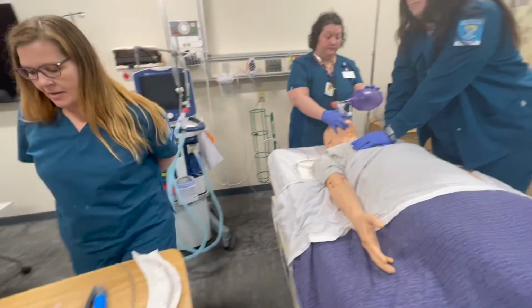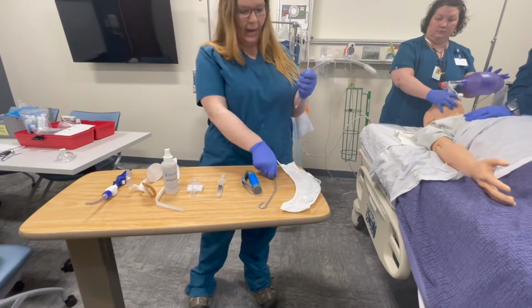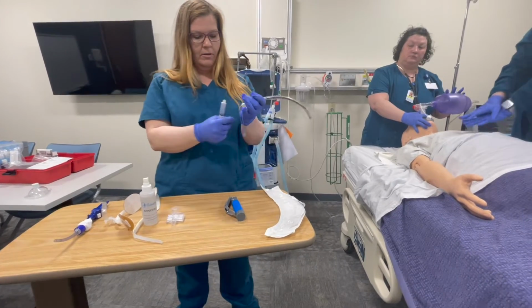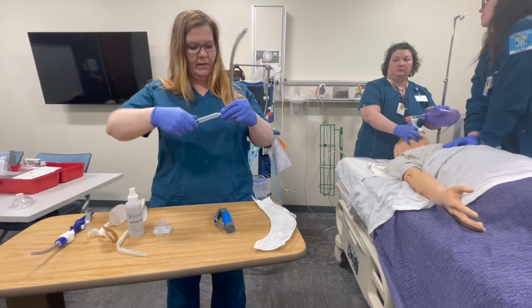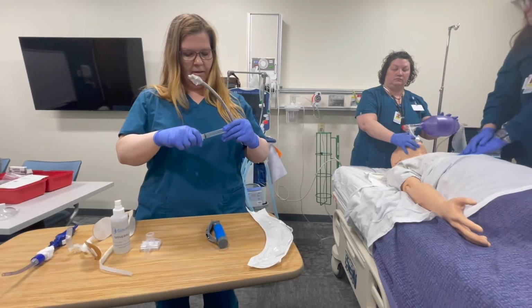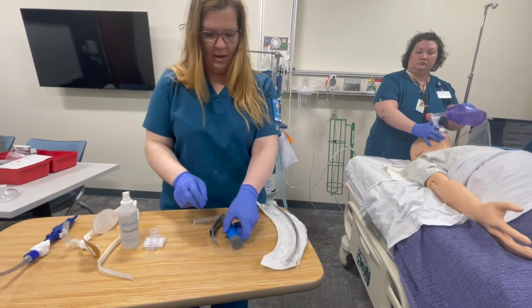Okay. So here I have all my supplies. I have my size 8 endotracheal tube as well as a 7.5 for a backup. I have my stylet. I'm gonna go ahead and throw my stylet in. Syringe. So we're gonna go ahead and inflate the cuff, check for leaks. Let's say that's good.